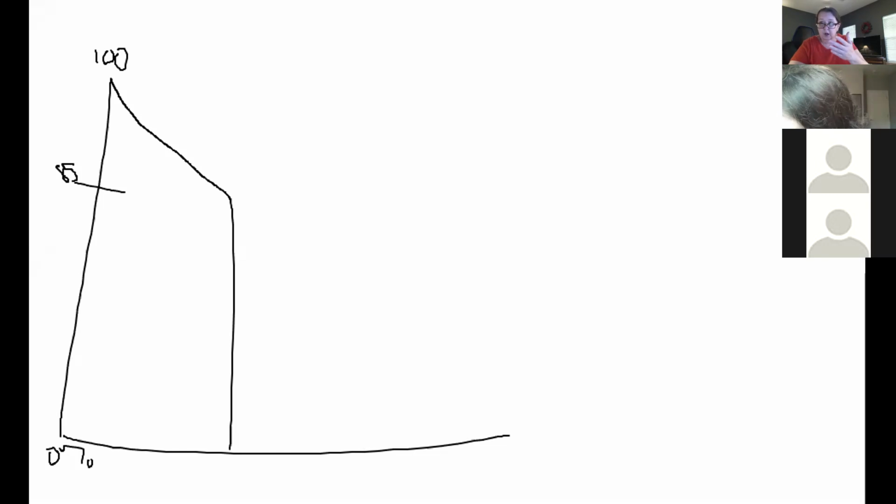Again, like for the tongue, let's say you put it on the lip, okay? You're going to clip it on the lip. You don't want the light shining through the fur side. You want the light shining through the lip side. So that's what I'm saying. If you're getting a crappy reading, how did you put the probe on? Is the light shining the right way?